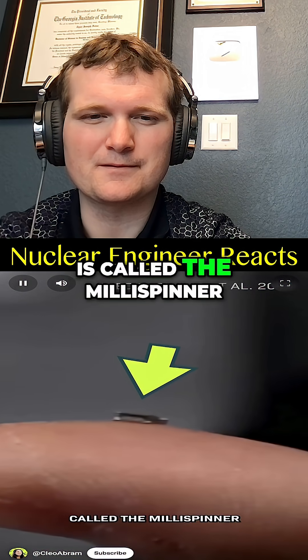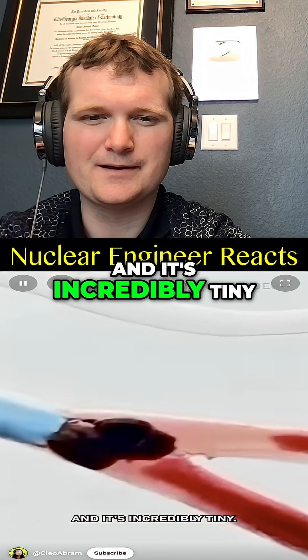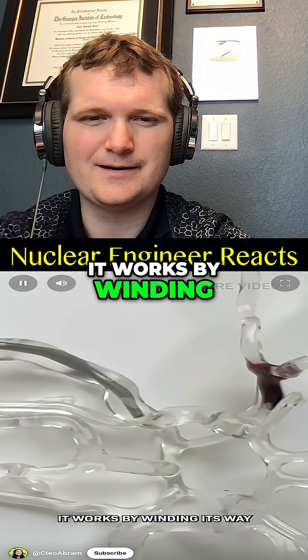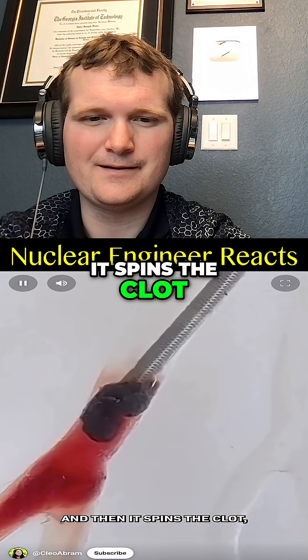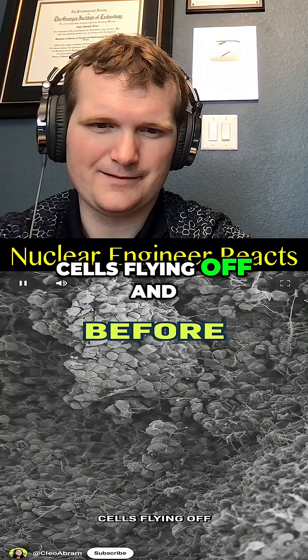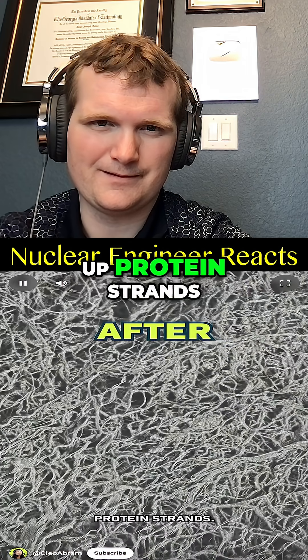So this new device is called the millispinner, and it's incredibly tiny. It works by winding its way through your blood vessels, and then it spins the clot, sending the red blood cells flying off and leaving behind the bunched-up protein strands.